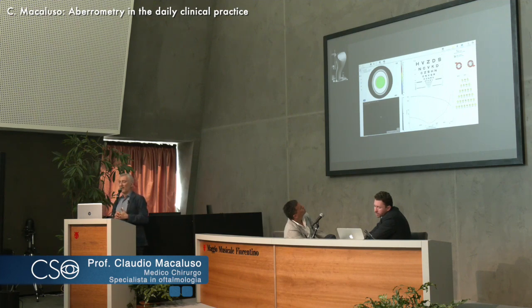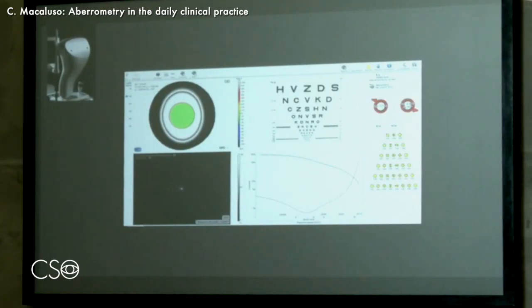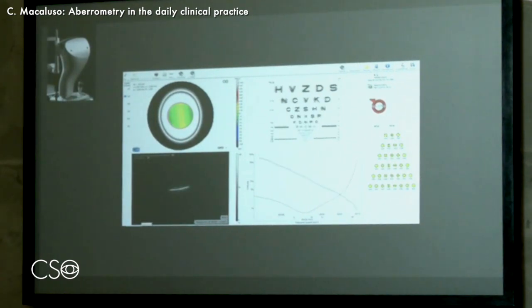And I find when I'm not finding an easy solution with the usual autorefractometer that the optometrist is using, going to this one, usually we get a better idea what is the best possible correction, and we get some surprises. But the result you see is like before, the PSF is very good, vision is very good. This is, to me, beautiful.